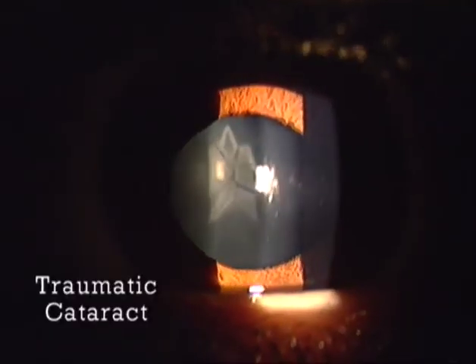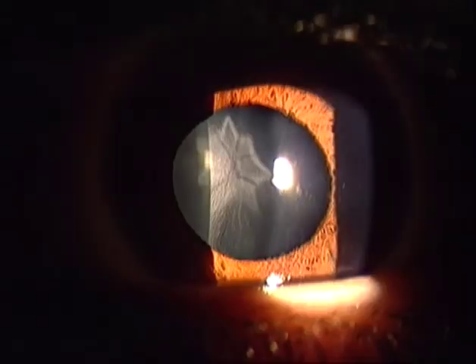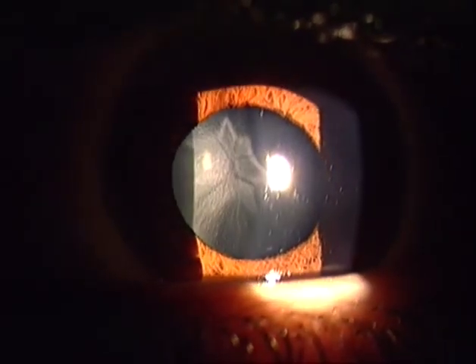However, in this case of traumatic cataract, the reflex becomes abnormally large, because here the anterior lens surface is abnormally flattened. Therefore, the specular reflex is wide and covers nearly the entire pupillary area and hides the star-shaped cataract.